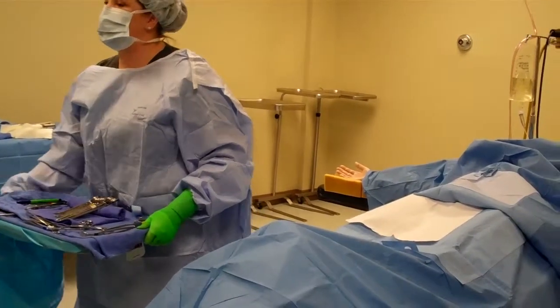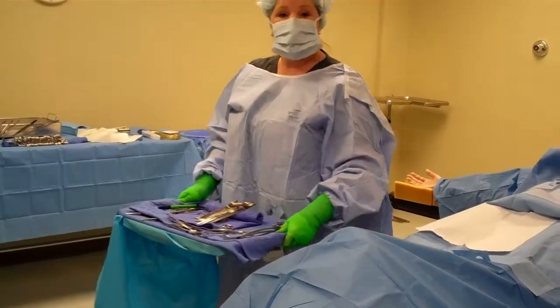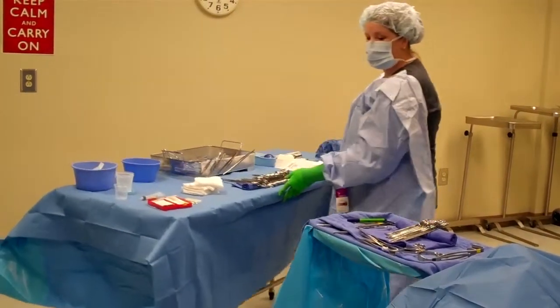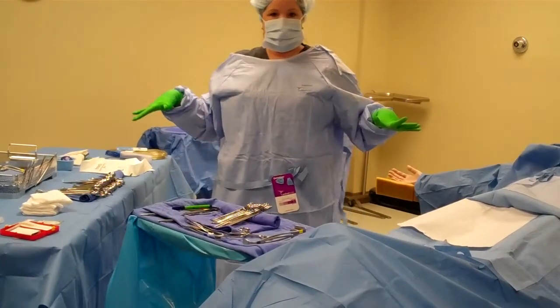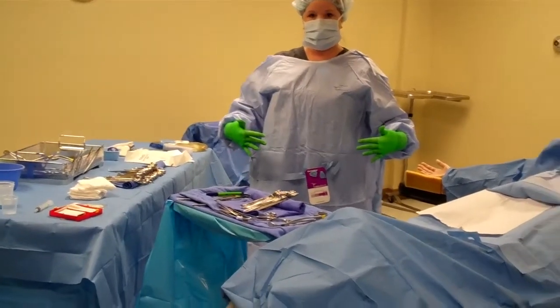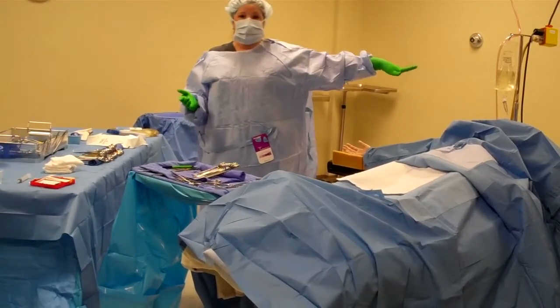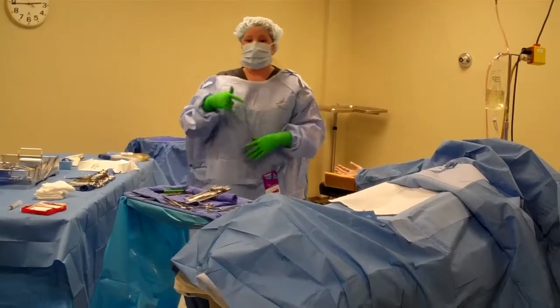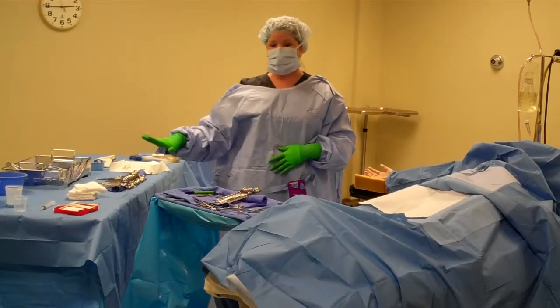This is not going to work. This is the messed up one. Okay. This will be right here over my patient. Then I will move my table closer to me. So I have my own little area that you will need to stay away from if you are not in blue. Okay? Now your circulator or your anesthesia may let you get up the top, get on some stools so that you can see better, or you could be at the end of the patient. Just make sure you're away from the blue.